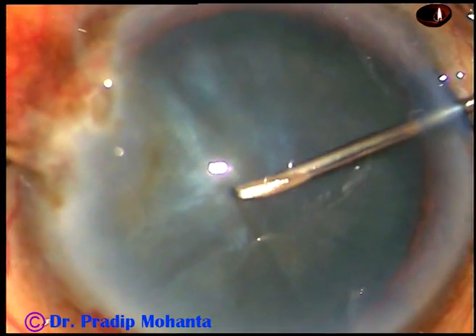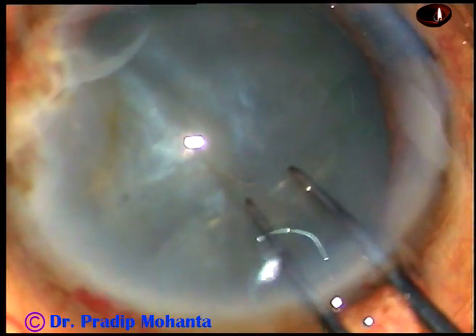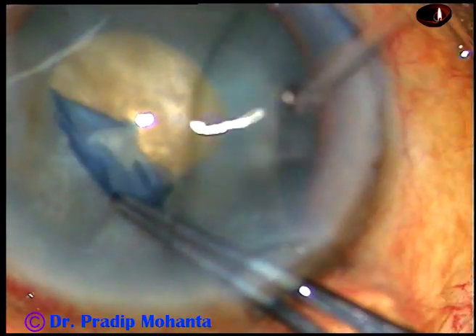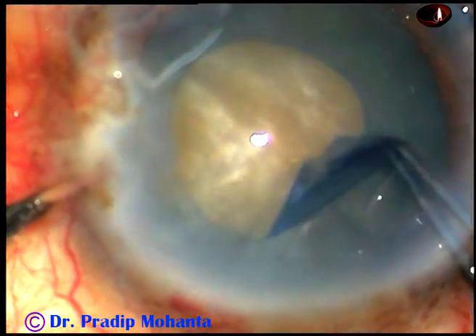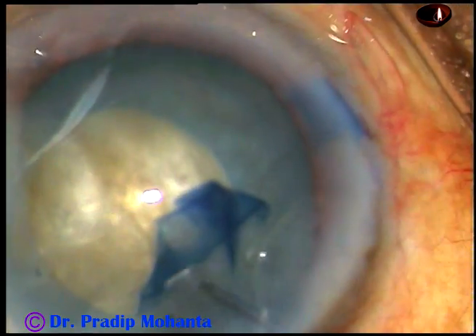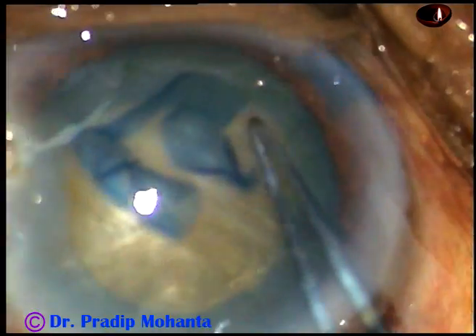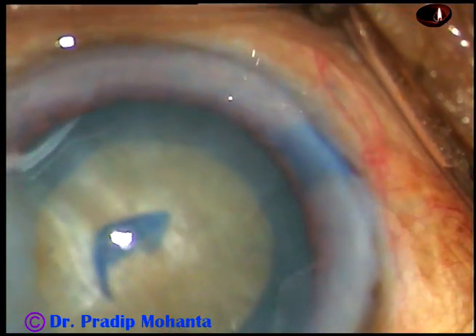But as soon as the anterior capsule is punctured, nothing came out, indicating normal intralenticular pressure. So though I started the rhexis, I thought of doing a small rhexis. I went to the periphery and did this spiral rhexis to increase the initial rhexis size and to do an optimum-sized rhexis.